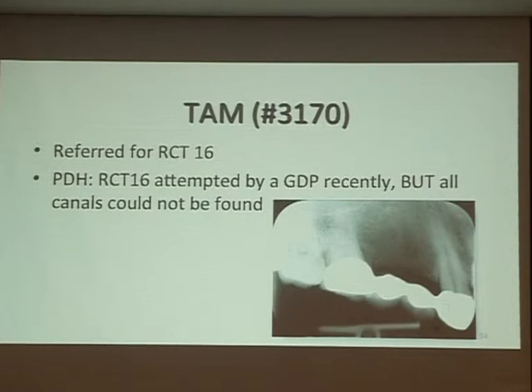This lady was referred to me for endo on this one. It's a new bridge made 2 months ago. The patient lost two premolars, and the bone quality is not good for implants. So the dentist put in a 4-unit bridge, but she's in pain. The dentist is worried because the patient is upset. They spent a lot of money on the bridge, and there's pain. When the dentist started the endo on this one, he couldn't find any canal. So he's worried, so he sent the case to me.